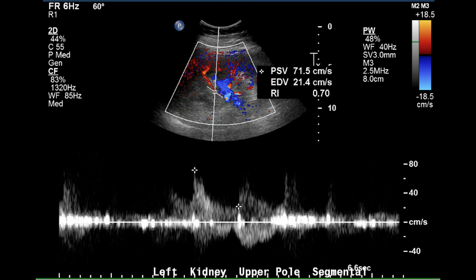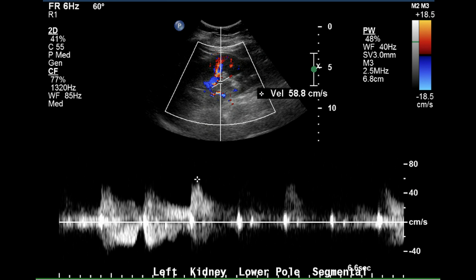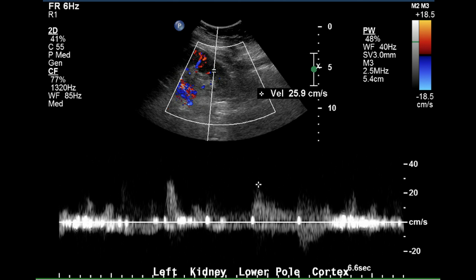The upper pole has a segmental vessel with a sharp upstroke, and the resistive index was measured at 0.7, which is a normal number. One of the arcuate vessels appears to show low resistance flow, although the Doppler waveform is suboptimal. The Doppler waveform in the lower pole left segmental demonstrates nice low resistance flow with a visible pre-dicrotic notch and velocity within normal range. The arcuate artery in the cortex at the lower pole of the left kidney also has low resistance flow, though the resistive index was not measured.